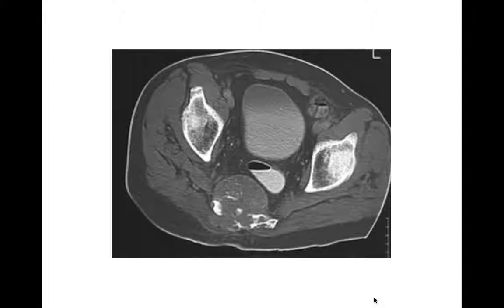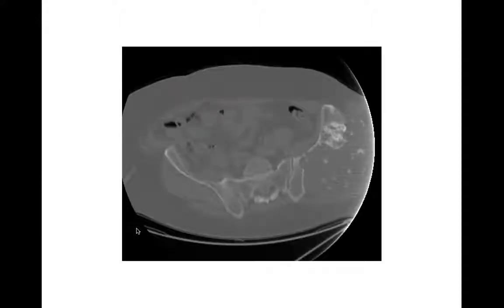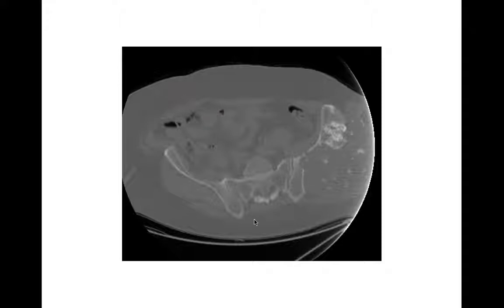Chondrosarcoma would be a good differential here if you think you see chondroid matrix — this one turned out to be a chordoma, but chondrosarcomas also occur on the midline of the sacrum. Here's a chondrosarcoma arising off the iliac wing — not the sacrum — just to show you the chondroid matrix and soft tissue mass arising from this aggressive lesion. Chondrosarcomas are another one that can occur in the sacrum.